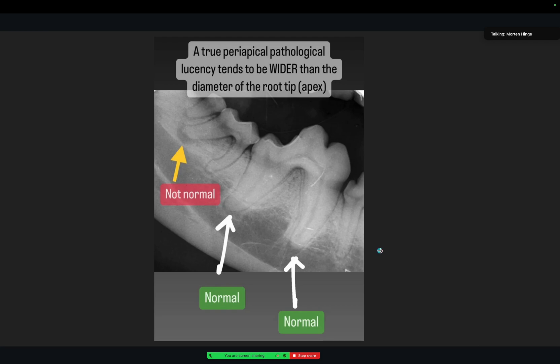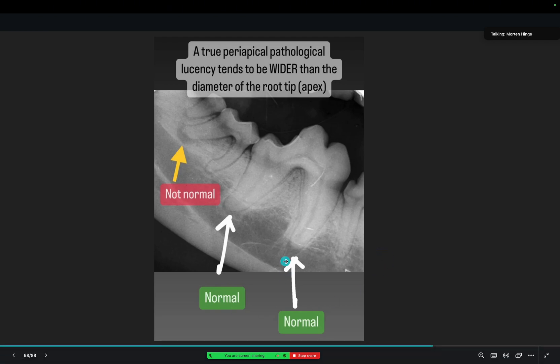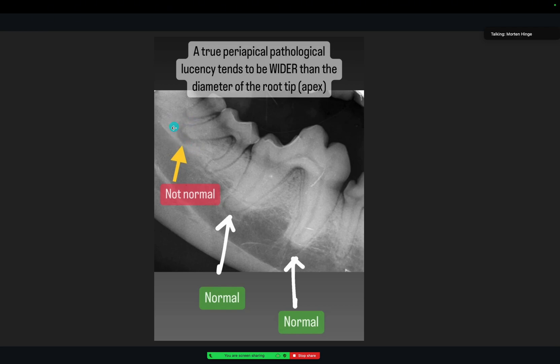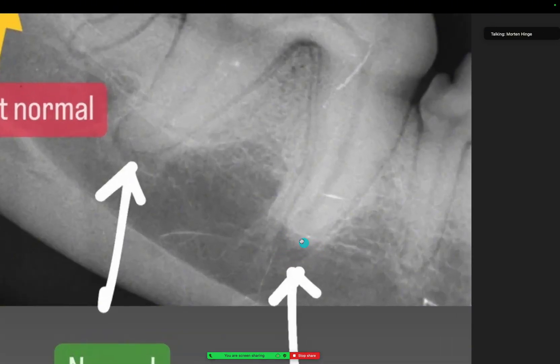The last thing is the molars — let's look at some of the molars. When you have to determine if this is an abscess or a lucency, this is a common area of doubt. This is completely normal — that's the chevron sign we talked about, that little triangular lucency here and also here. It's not always triangular, but there's a lucency. And here — this is a pathological lucency. A true periapical pathological lucency tends to be wider than the diameter of the root tip. If the round area of the lucency extends on either side of the root tip, it's wider, then it's probably pathological. But in this case, that chevron sign lucency doesn't have a bigger diameter than the root tip — so this is normal.